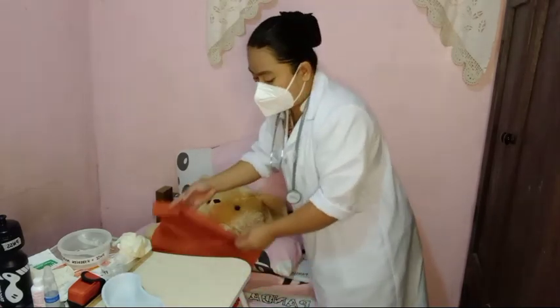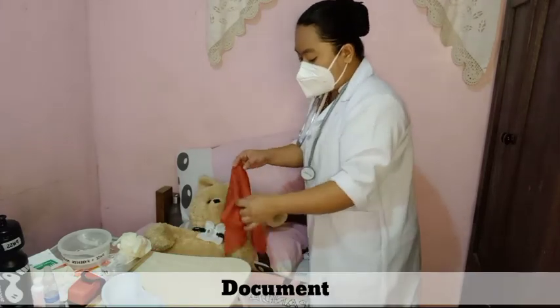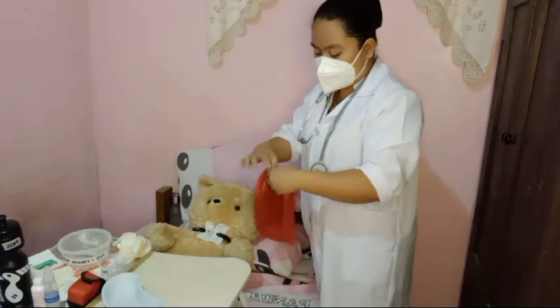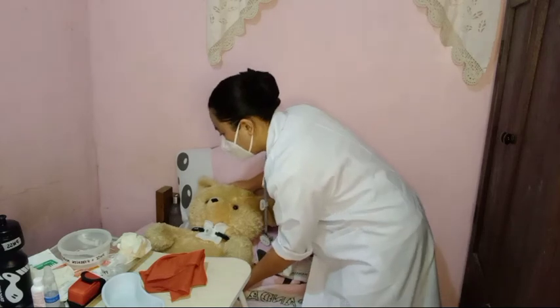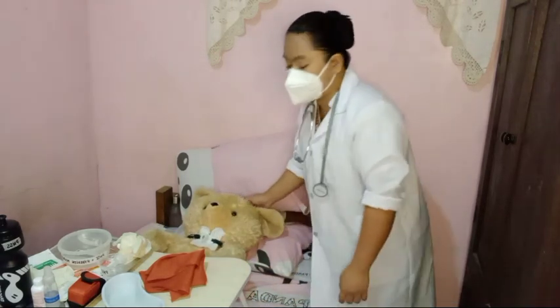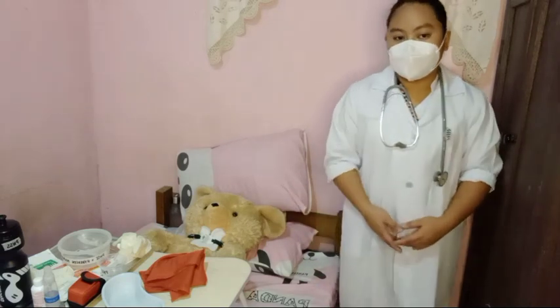Remove PPE if used and perform hand hygiene, then document. Position the client in a comfortable position.